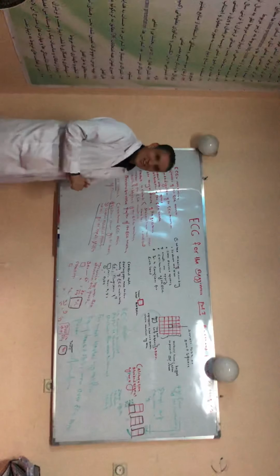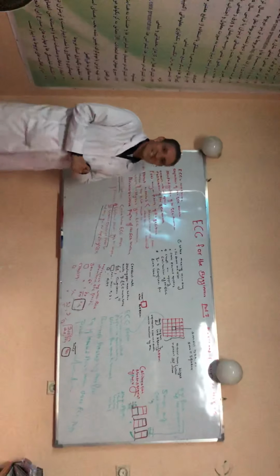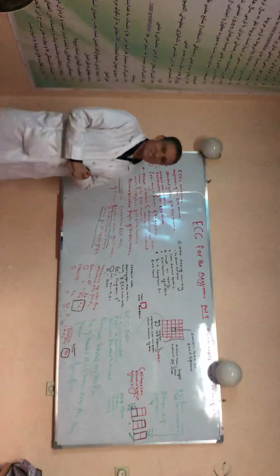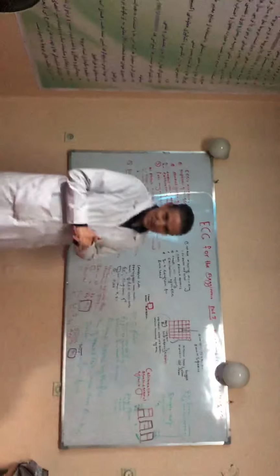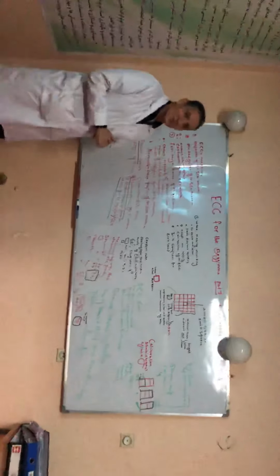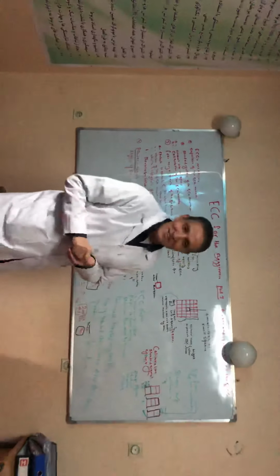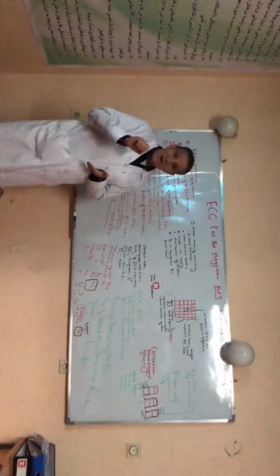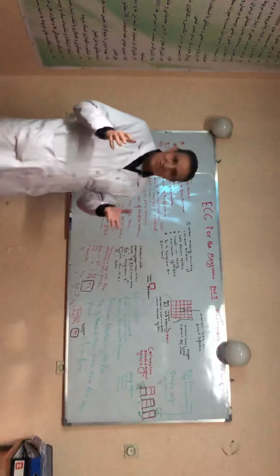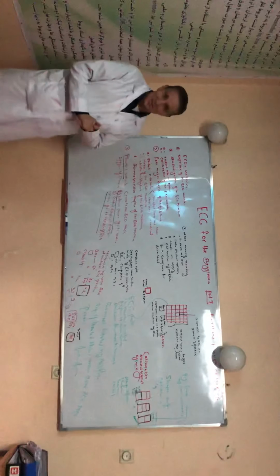In the first lecture, I told you ECG is one of the most widely used and useful investigations in contemporary medicine. ECG provides valuable information about different cardiac problems, particularly arrhythmias. So ECG is one of the oldest, simplest, cheapest, easily portable electromedical instruments which immediately provides a lot of information about cardiac problems, particularly arrhythmia.